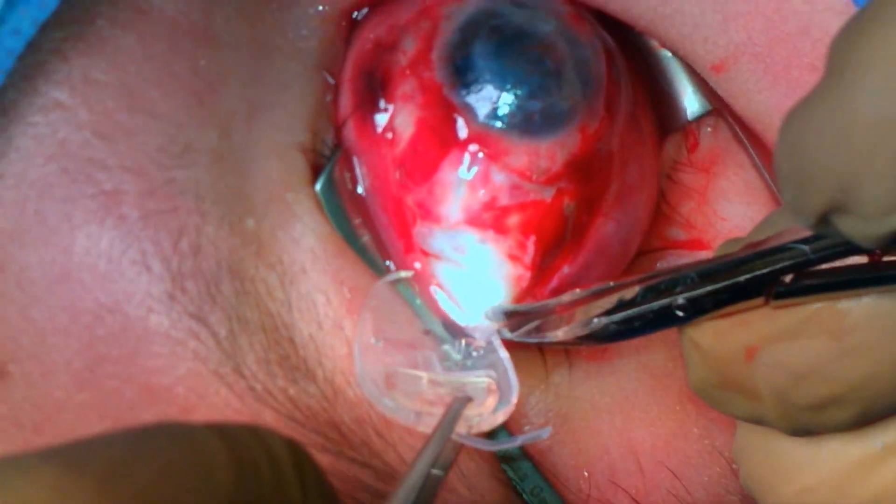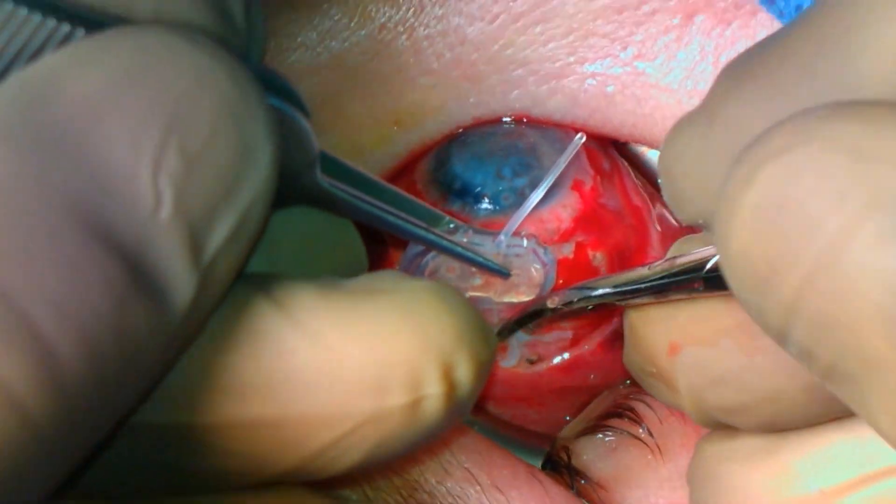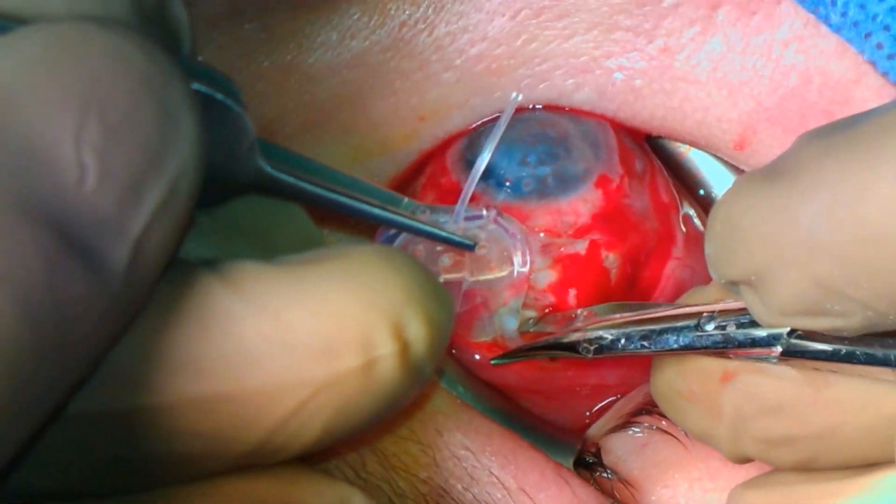Once the implant is freed, it can be sent to the pathologist for gross examination and the remainder of the surgery can proceed.